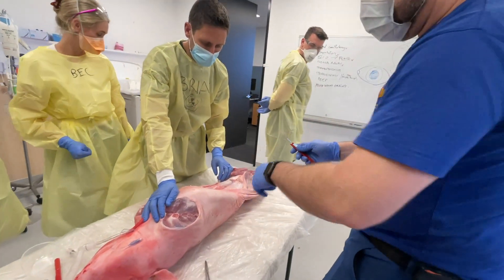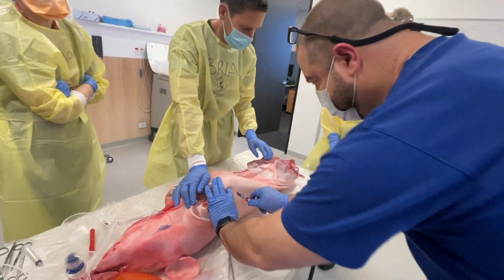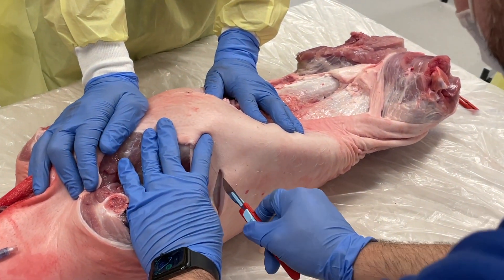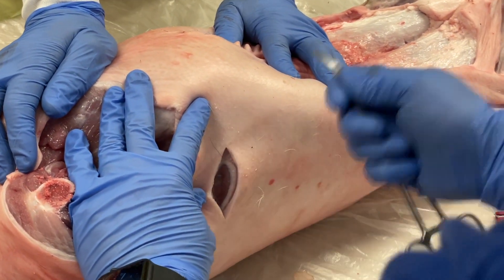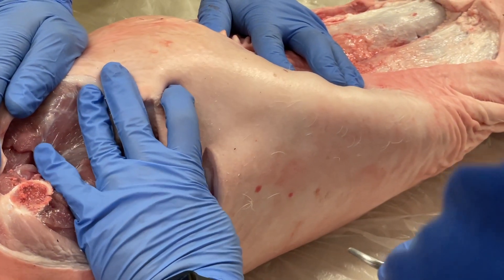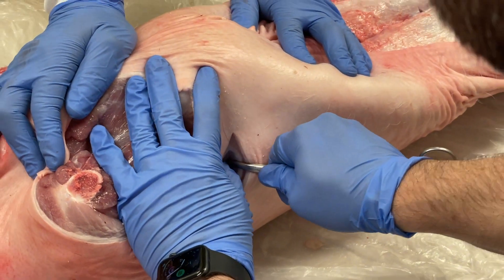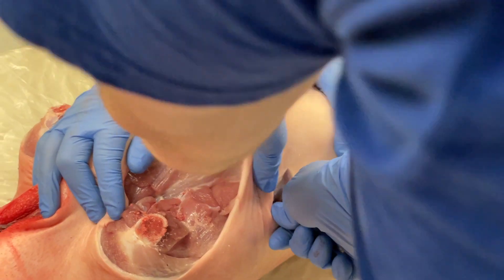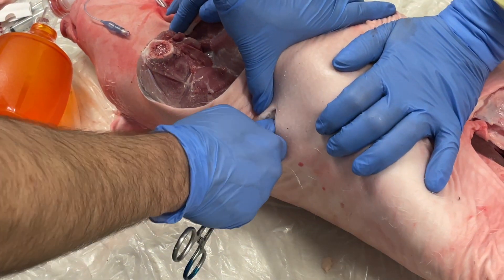We're going to identify the landmarks again — fourth intercostal space and fourth intercostal space only. Four to five centimetre incision, mid-axillary line. So we're going to go through skin and down into that first pink plane, so a little bit deeper than what you think. Make sure that your scalpels are sheathed and out of the way. You're going to use your forceps in an anti-plunge grip. You're going to feel that rib space that you're going for, get over the top of the margin of that rib. I've gone over to the next one — pop through. You can feel that pop through.